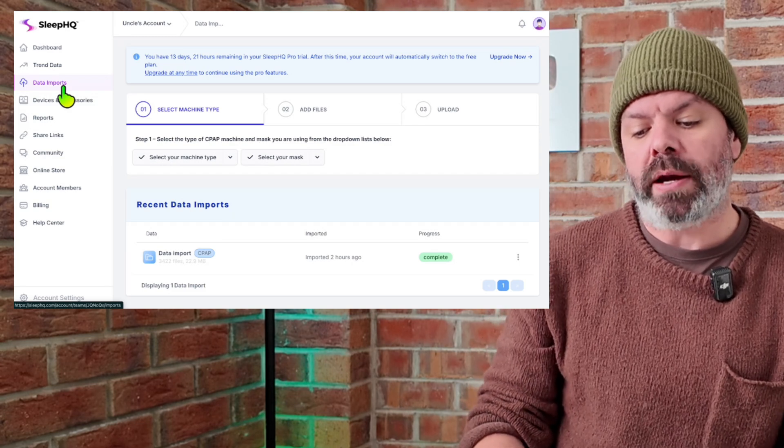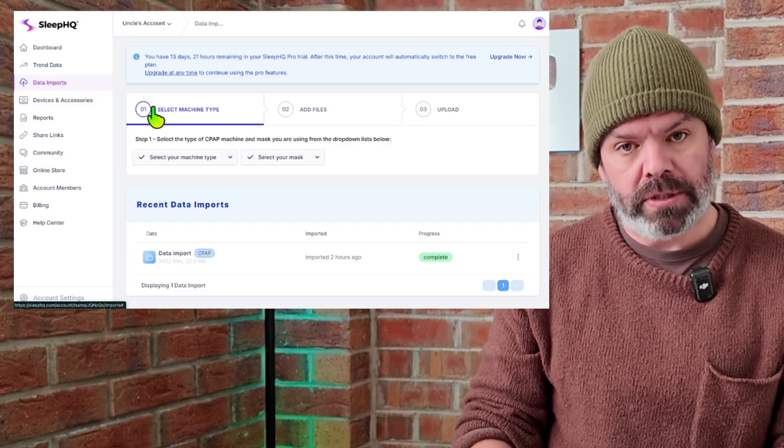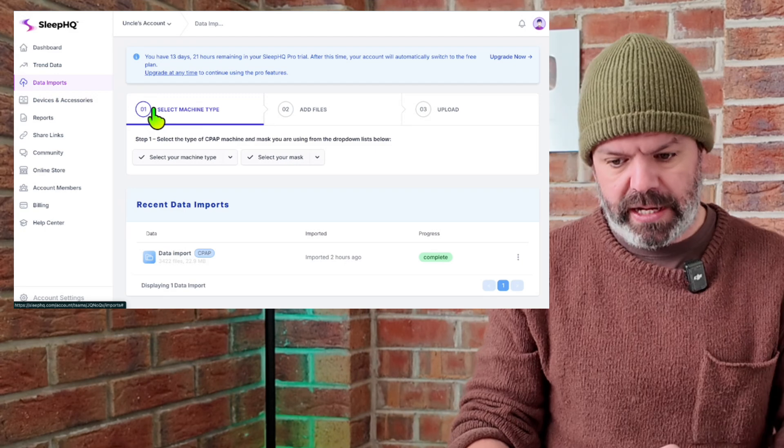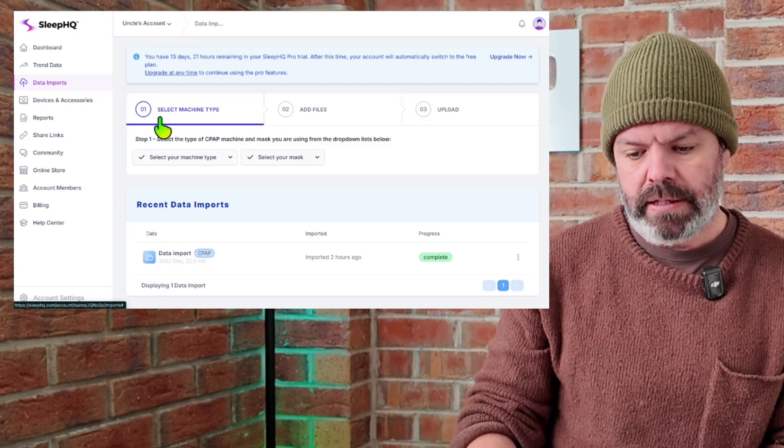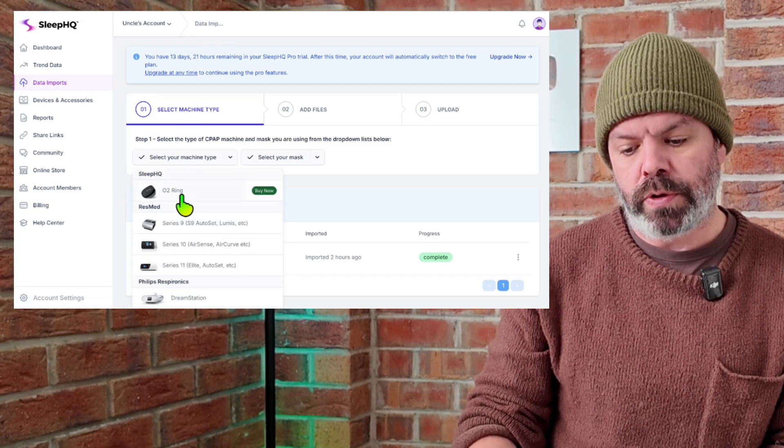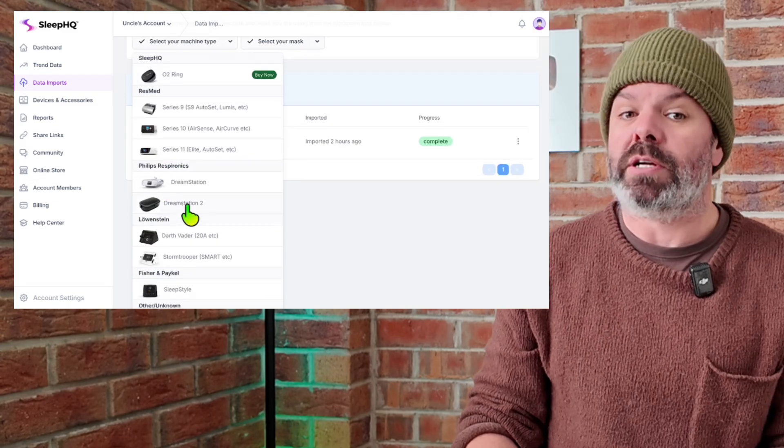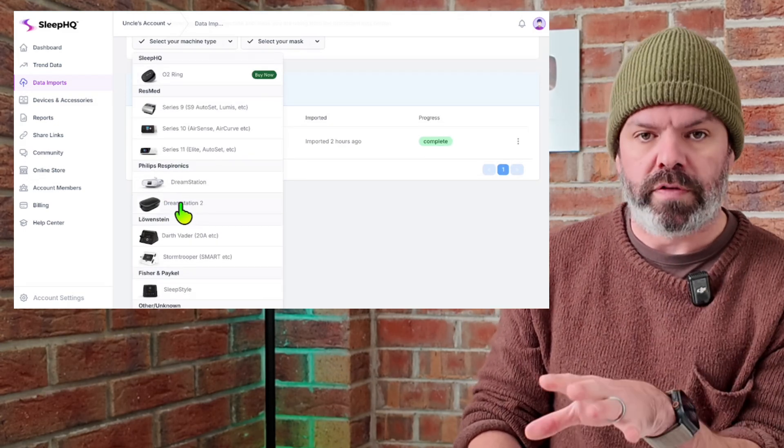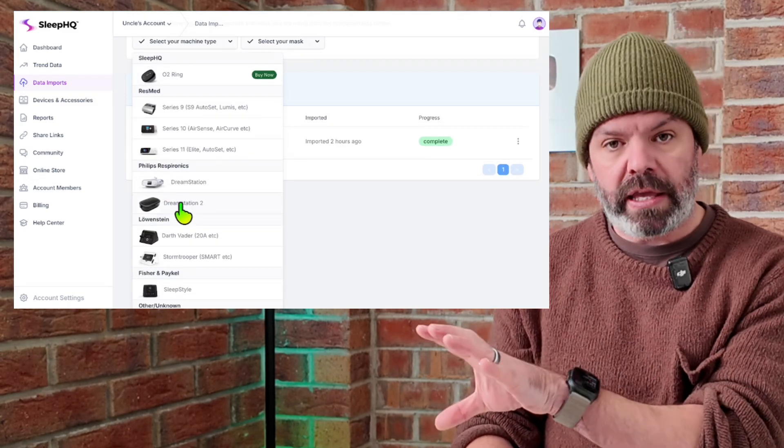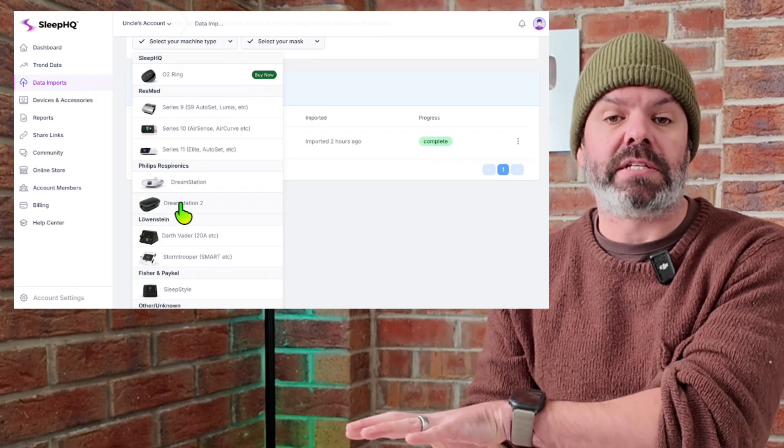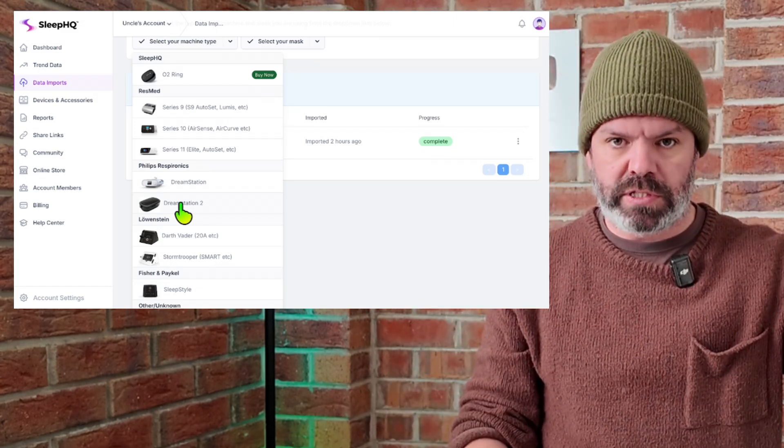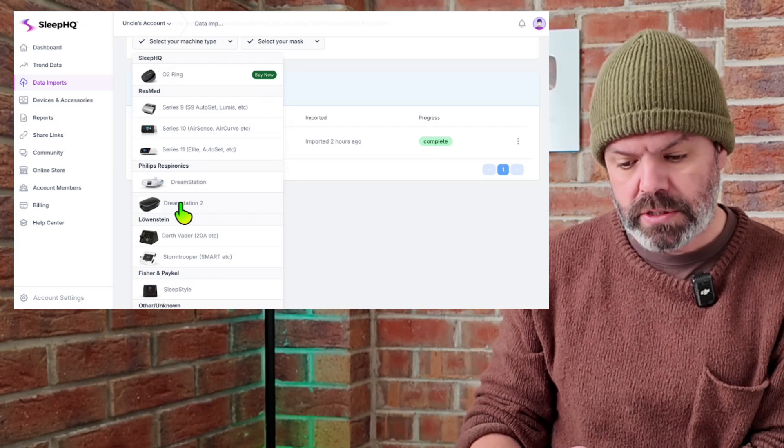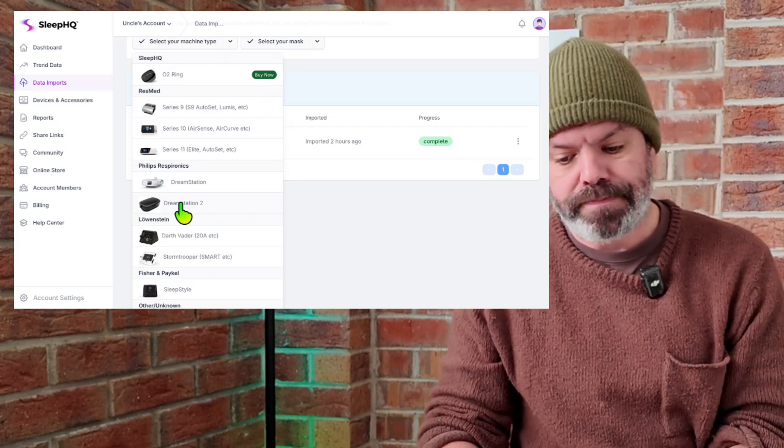Now step one, we're going to select our machine type, DreamStation 2. So I'll click here and then scroll down to DreamStation 2. It's pretty much the same process for all the devices here. We're just dragging and dropping the contents of the SD card into the import section, begin upload and you're good to go. So I'll select DreamStation 2.